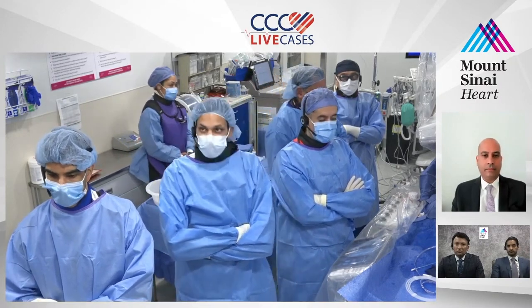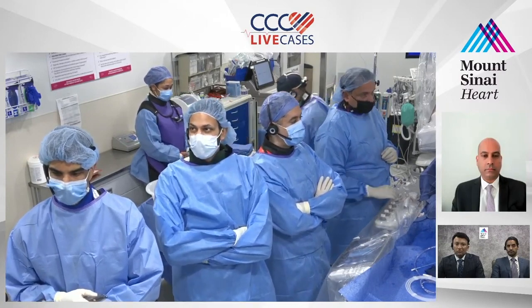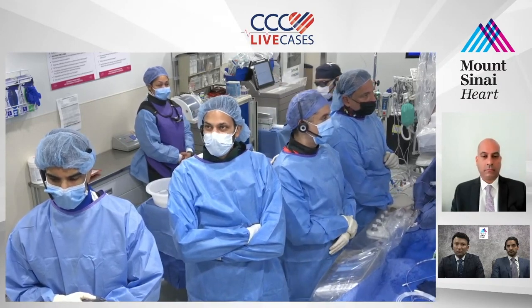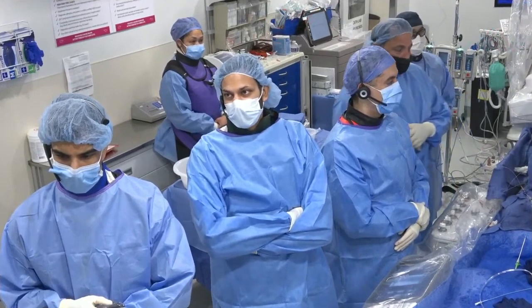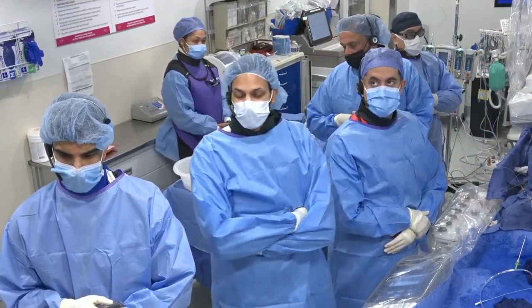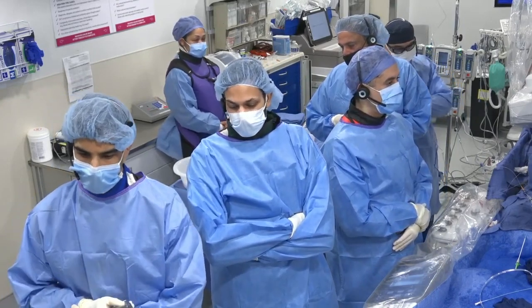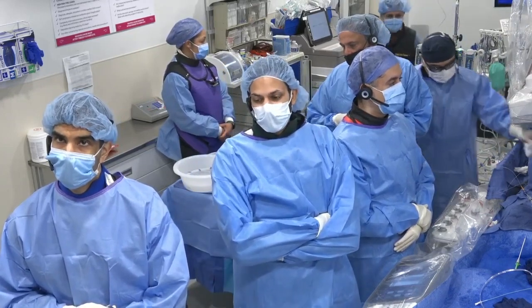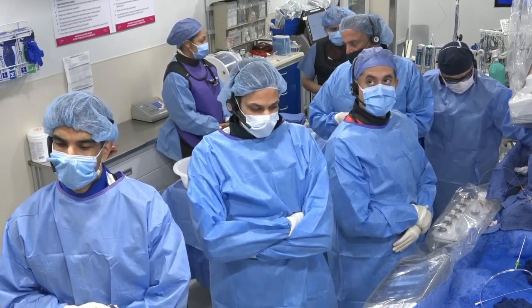Yeah, I think this is a very challenging case, and I think it's interesting for multiple reasons. Number one is just choosing the access site, because there are so many different options here, and each has its pros and cons. But I agree with a pedal approach here, because as we know, going up and over with an aorto-bifem is very, very challenging. It's that acute angulation of the graft, and the last thing you want to do is disrupt your anastomosis at the proximal end too. We have steerable sheaths and things like that, but it's still very challenging. So I agree with pedal access.